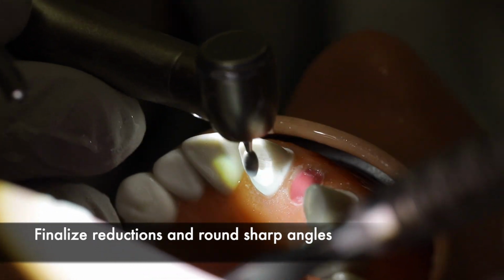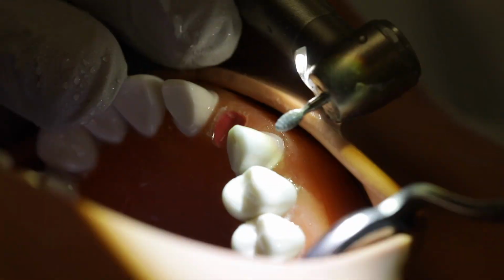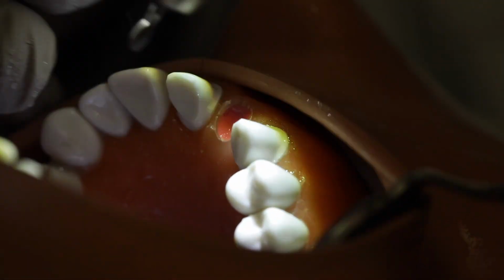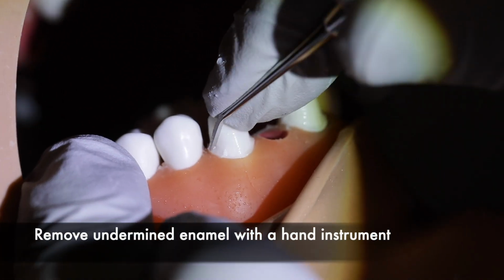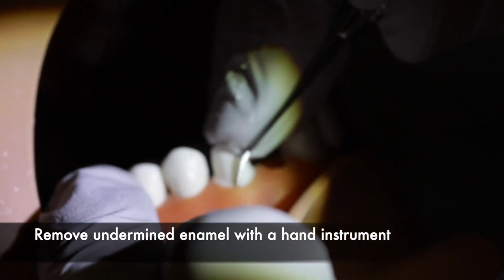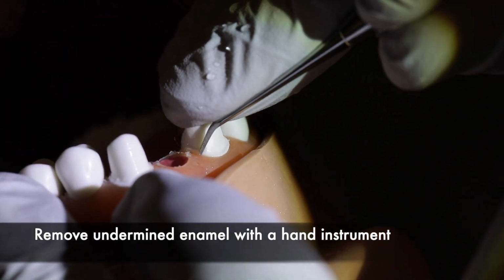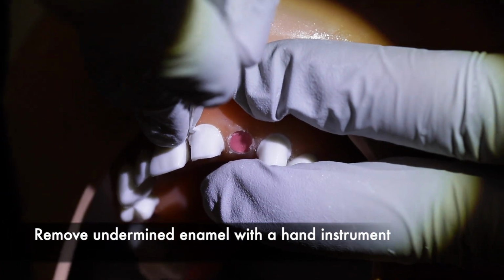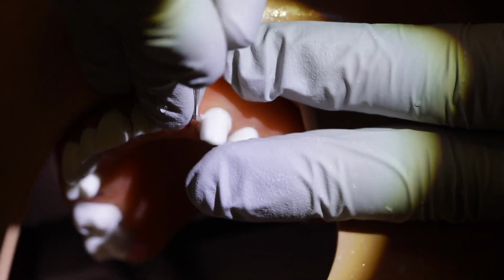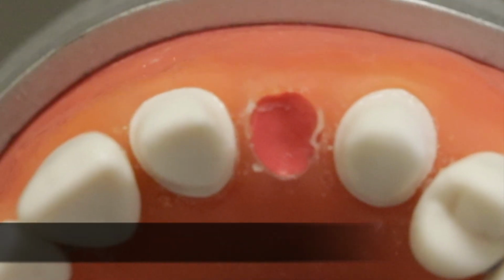Also, make sure you round all sharp edges. At this stage, you're going to start finalizing your preparation. Using a hand instrument, you're going to make sure you remove all the undermined enamel and the J margin from your finish line. In this view, you see both finish lines are showing at the same time.